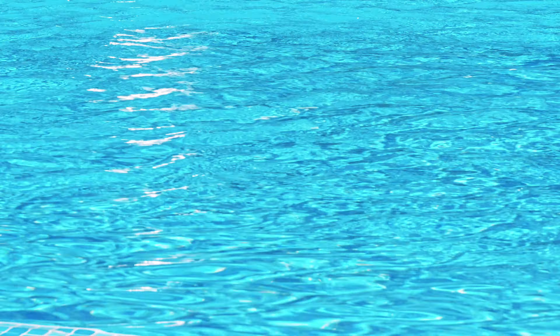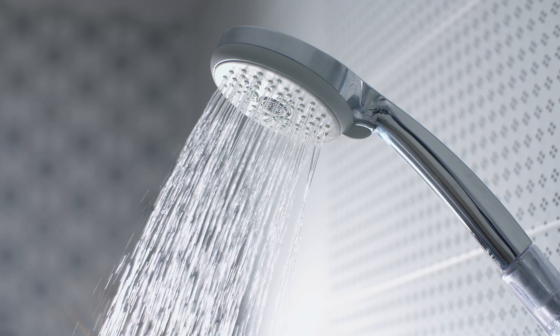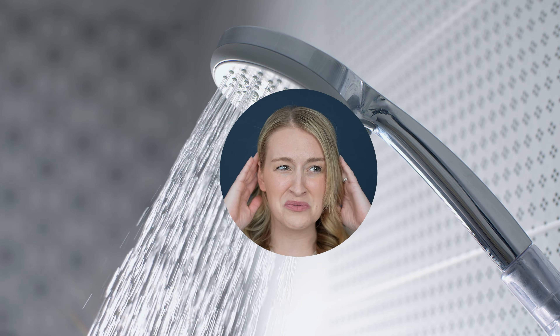You know that feeling in your gut when you realized, oh, I just messed up — the one that's typically followed up by some slight panic and the immediate jump to: how can I fix this? If you wear hearing aids, you may have already experienced these feelings by jumping into a pool or a shower only to realize seconds or minutes later, oh no, I still have my hearing aids on.